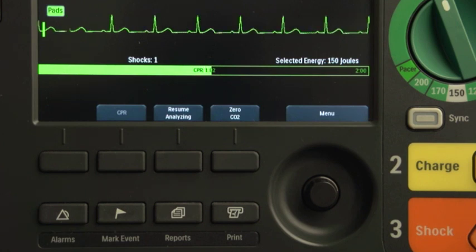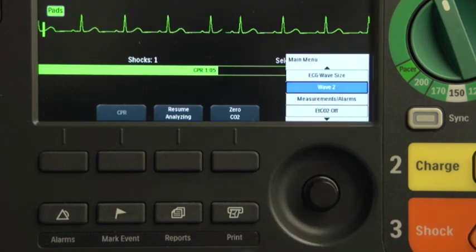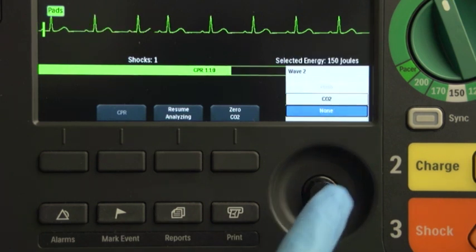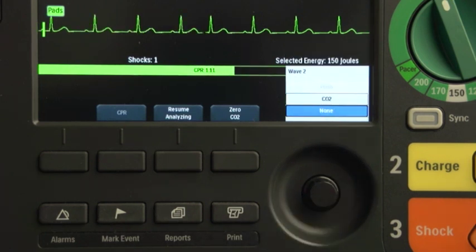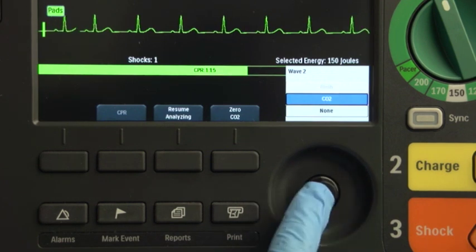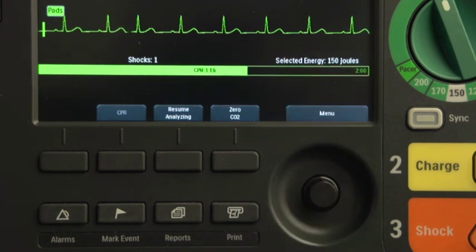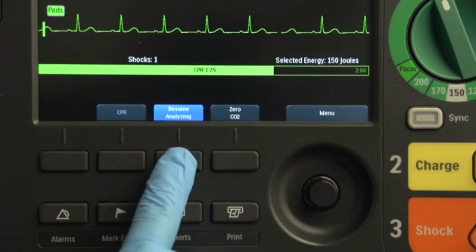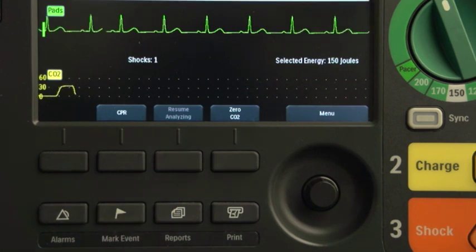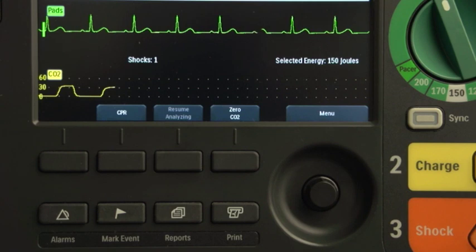To assign a wave to WaveSector 2, press the Smart Select knob. Highlight Wave2 and press the Smart Select knob. Select the wave you want placed in WaveSector 2 and press the Smart Select knob. When the pause period ends or the Resume Analyze button is pressed, the newly assigned wave appears in place of the Pause Progress bar.